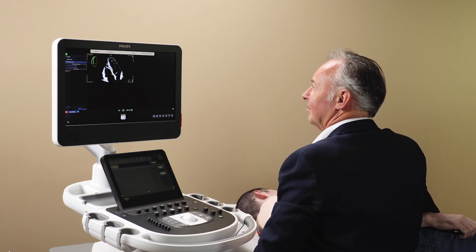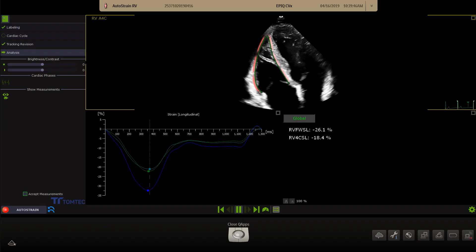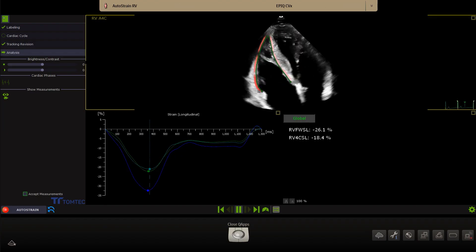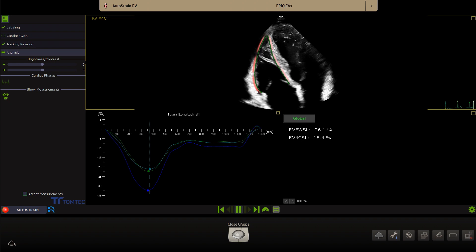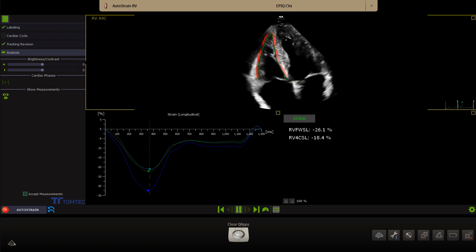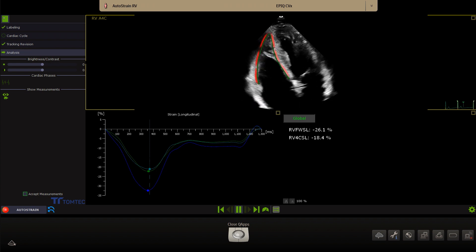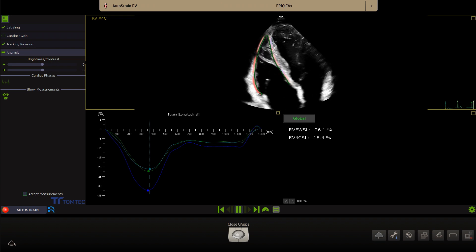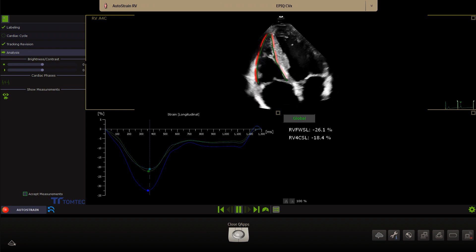The one-button-push Autostrain RV provides a fast and reproducible longitudinal strain measurement of the right ventricle. The AutoView recognition and Auto ROI placement algorithm automatically assigns the view label and places the contour of the right ventricle.